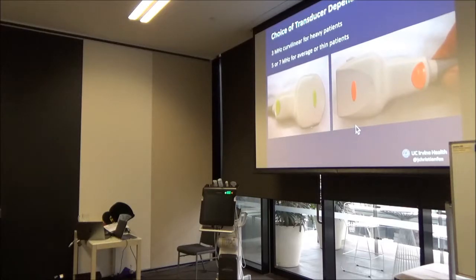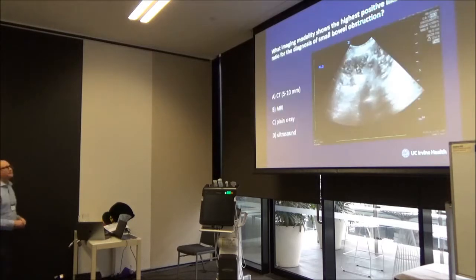Yes? Do you have a particular preference for preset on that linear probe? Yeah, that's a good question. I like the DVT preset on the linear probe when I'm looking around for appendicitis, because it tends to be a lower frequency bandwidth on the DVT preset, because it's trying to get down to a deeper venous structure. In general, that's not a rule or a guideline or anything like that. You could try different settings, see which one you like better. A small part setting sometimes is okay too. So yeah, you try to get away with linear, particularly with appendicitis.